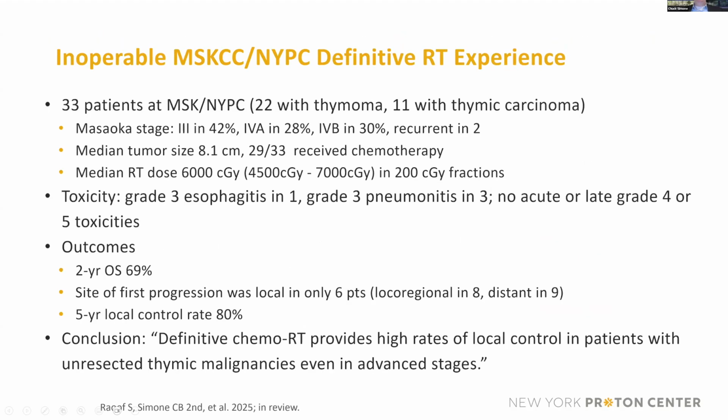What about completely inoperable thymic patients? Well, this is our experience. We have this in submission and press now. 33 patients that we treated at the New York Proton Center and Memorial Sloan Kettering.